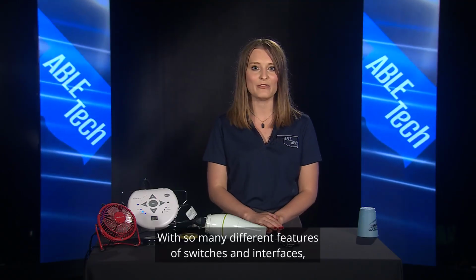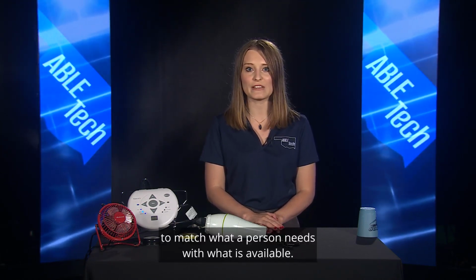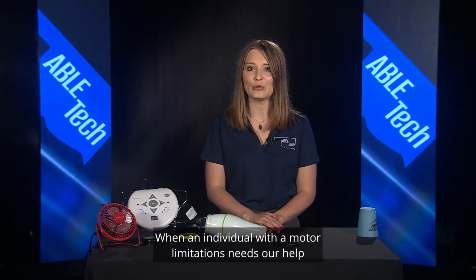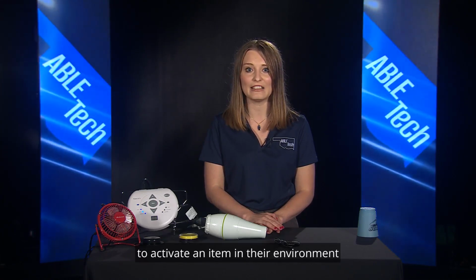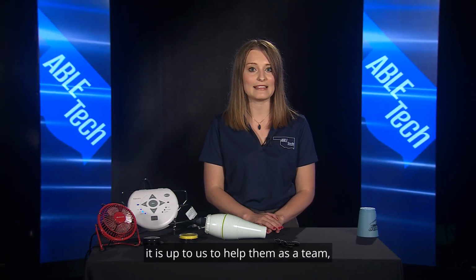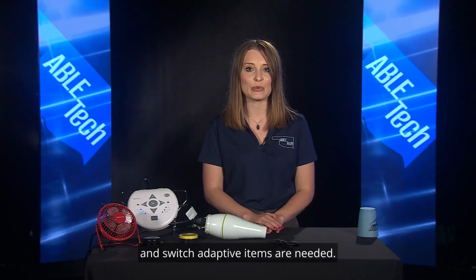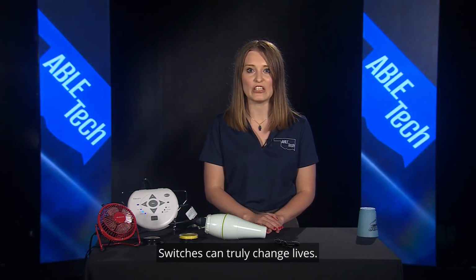With so many different features of switches and interfaces, it is truly a challenge sometimes to match what a person needs with what is available. When an individual with motor limitations needs our help to activate an item in their environment, it is up to us to help them, as a team, determine what switch or switches and switch adaptive items are needed. Switches can truly change lives.